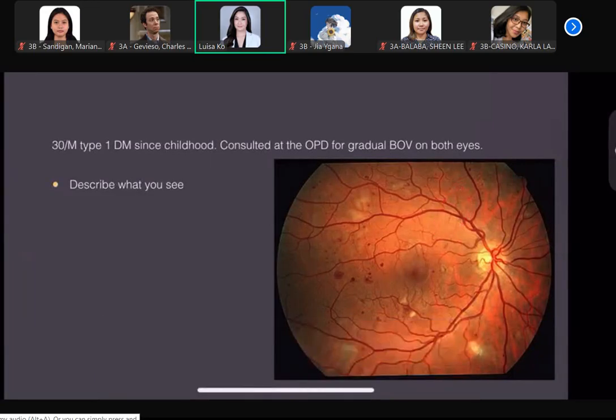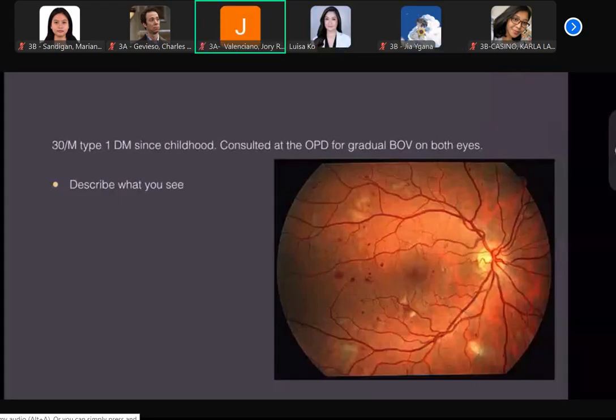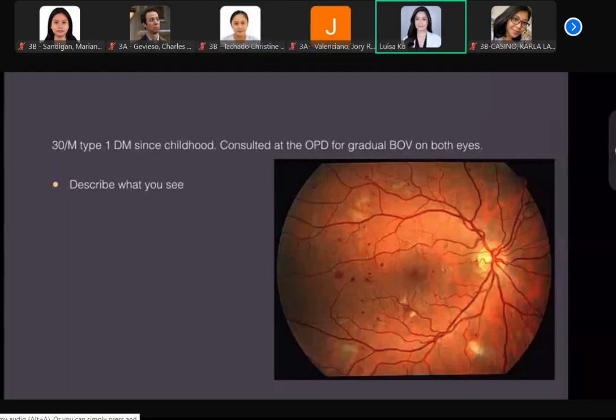We agree? Sige. Let's take a look at the retinal periphery. What do you guys see there that should not be there? Blood, no? So what kind of blood? Dot and blot hemorrhages, Doc. Very good. What else? Cotton wool spots. Very good. There are also cotton wool spots, notably in the inferior vascular arcade, inferotemporal vascular arcade. If we take a look more closely, we'll probably see areas of retinal microaneurysms and etc.